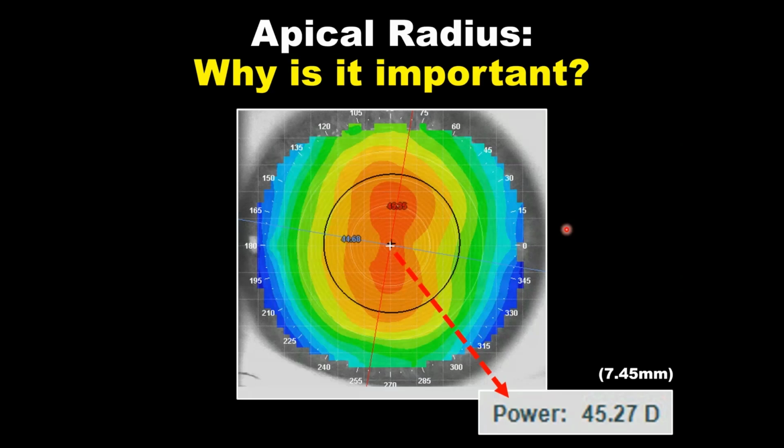Now let's consider another point of reference to understand how steep or how flat the eye is. And that's the radius of the cornea at the center. So not the K readings at 3 millimeters out. Let's look at the central radii of the cornea. This is also known as R0, meaning radius at 0 distance from the center.